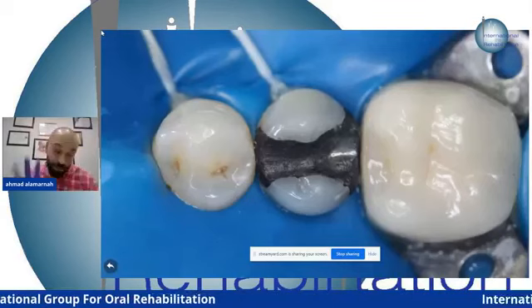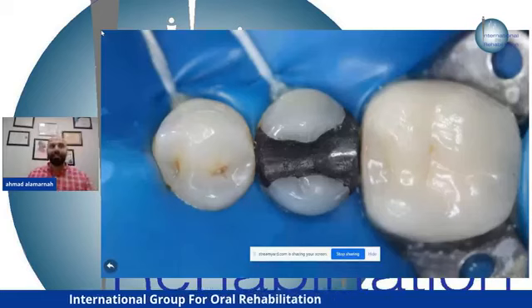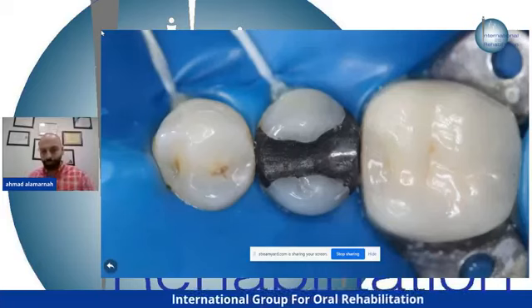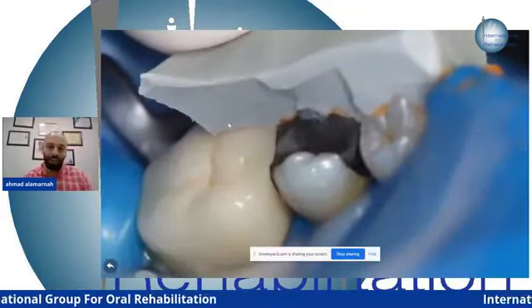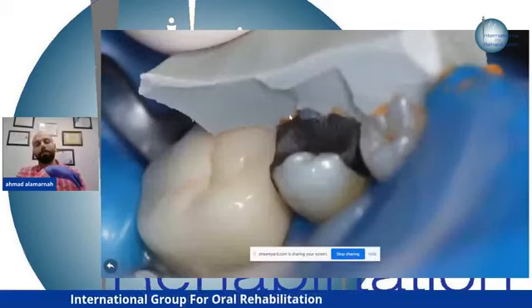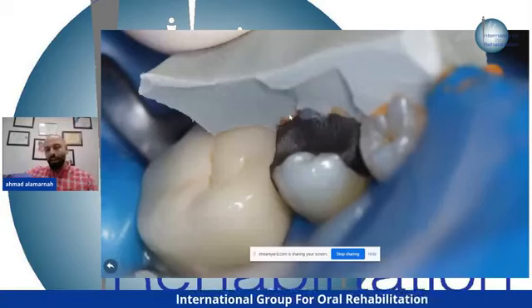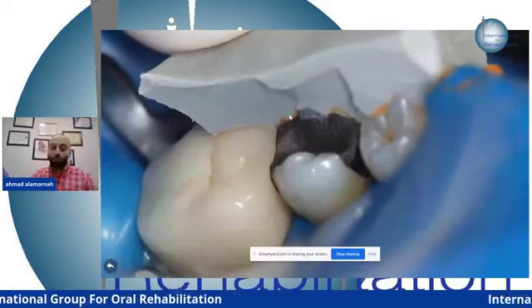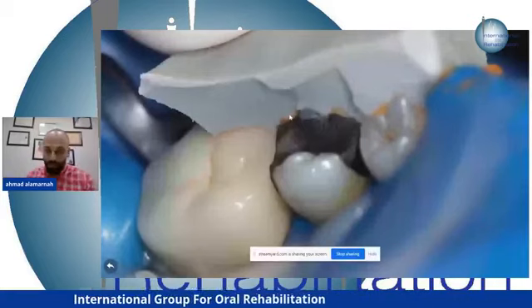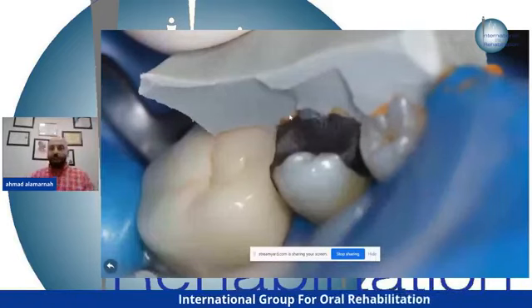After I saw this type of restoration, first of all, I took an impression with, I think it's Zeta Plus, okay? And I did a cut mold technique. If you want to know about it, it's like taking a stamp of the buccal and lingual cusps in order to replicate the same anatomy and the same height of the cusp. Because if you remove the buccal or the lingual cusp because of caries or lack of thickness, if it's less than 2 millimeter, you have a very huge cavity and you don't know what to do.